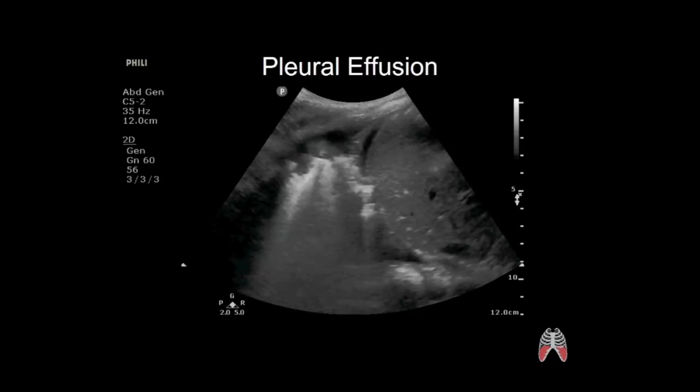So now we're looking at here. So what is a pleural effusion going to look like? For us, this allows us to say, okay, here's this kid, we have this. You may not even see all this on the x-ray, okay? Now for the emergency medicine people, or even for all of you, this is not anything where you say, okay, pleural effusion, great, let's start antibiotics and go. For us, the question is, how bad is the effusion? I can't tell you how many kids, when I get down there, already have a chest tube, and the tube is either not in the right place, or there's a loculated fluid. Using clinical exam, they'll listen to decreased breath sounds, think that's either pneumothorax or pneumonia, and move on. This allows us to at least see a little better.